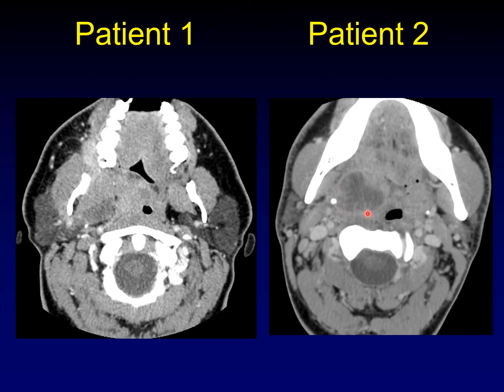Now, this is not a simple peritonsillar abscess. This one has extended through the superior pharyngeal constrictor muscle and into the parapharyngeal space. All of the parapharyngeal fat has succumbed to this abscess all the way out to the styloid process. So this is a complex peritonsillar abscess with involvement of the parapharyngeal space and destruction of all the parapharyngeal fat.